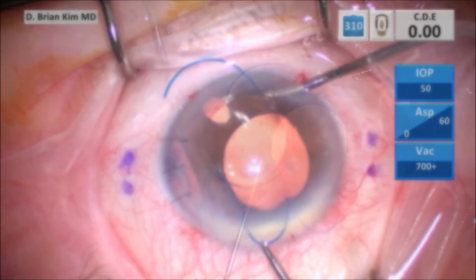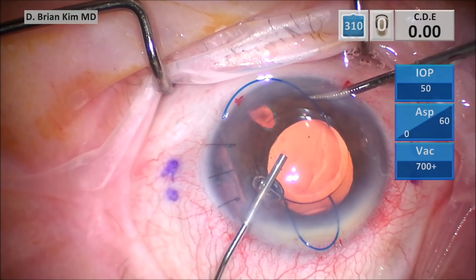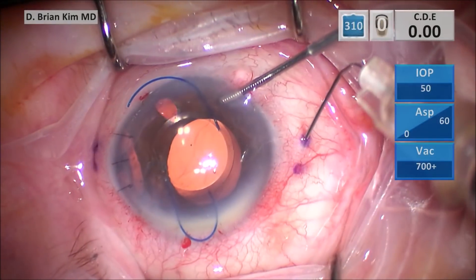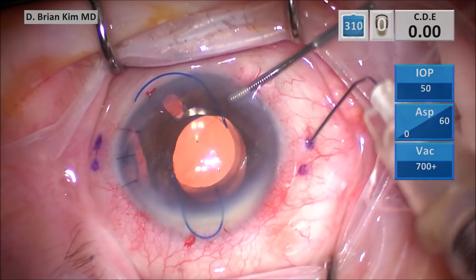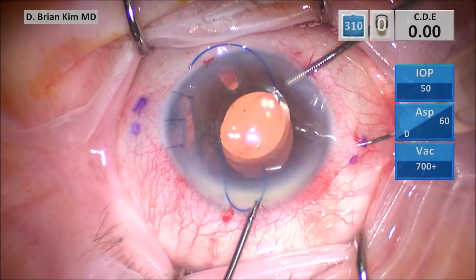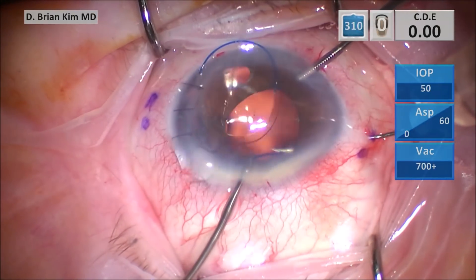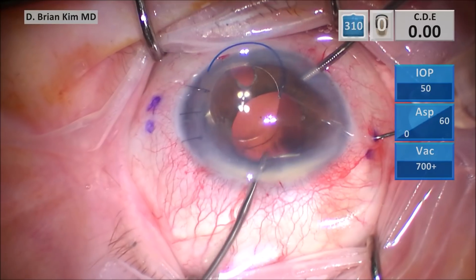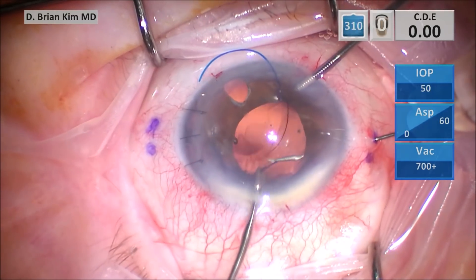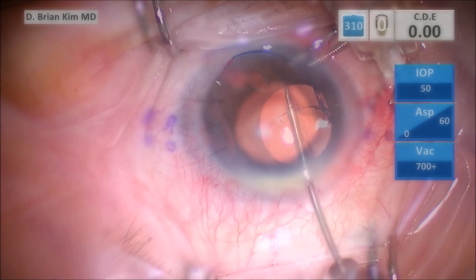I'm filling the eye with dispersive viscoelastic. Then I'm placing the right needle through the ink mark, tunneling two millimeters before diving into the anterior chamber. Now you can see the needle. I'm going to grab the haptic right at the apex of the U, and then I'm sliding the haptic into the needle. Pay attention that the needle has a docking platform, which I can use to help guide the suture and disengage from the needle.